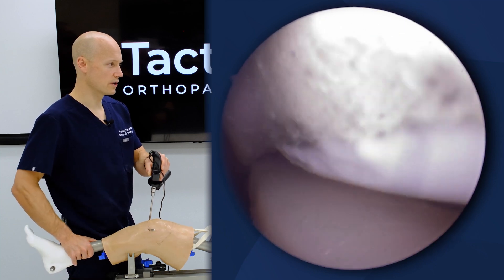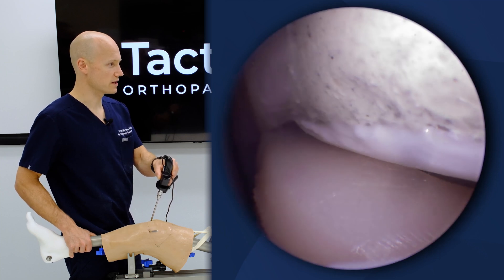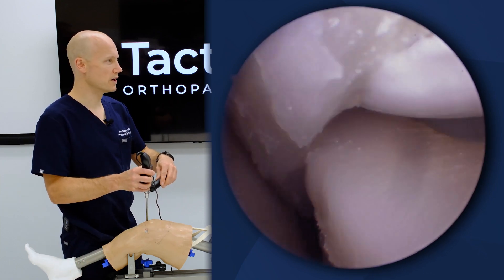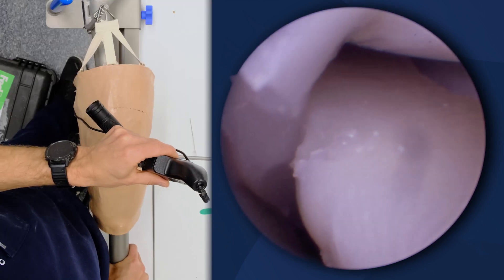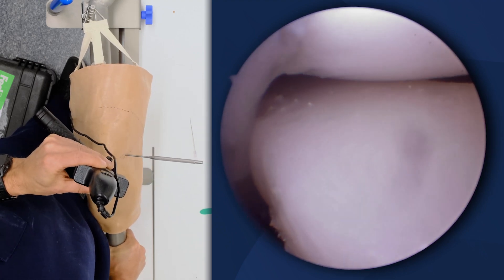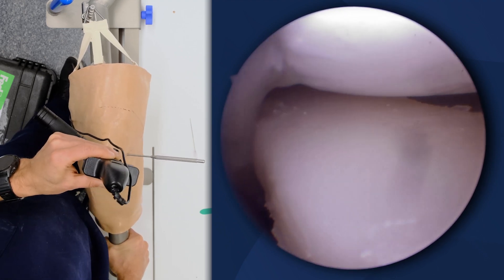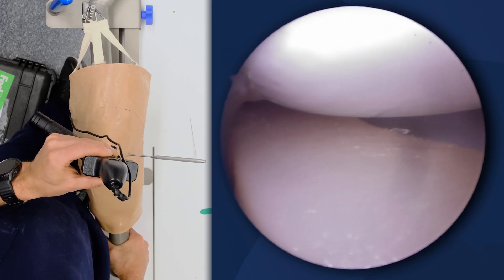Even further, we can see how in extension we're going to get some terminal external rotation and see more meniscus volume in terminal extension than as we flex. Coming along into the lateral gutter view, we can see the popliteus and the meniscus, where we can examine internal and external rotation, showing that we don't have a large component of either anterolateral or posterolateral rotatory pattern. The meniscus-popliteus femoral junction relationship is being well maintained in the model.